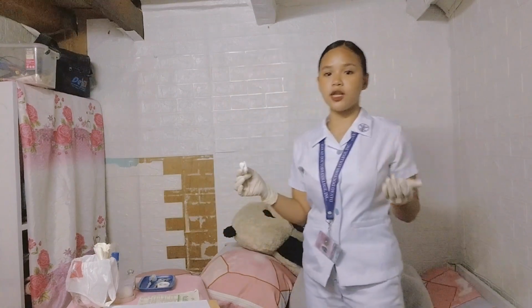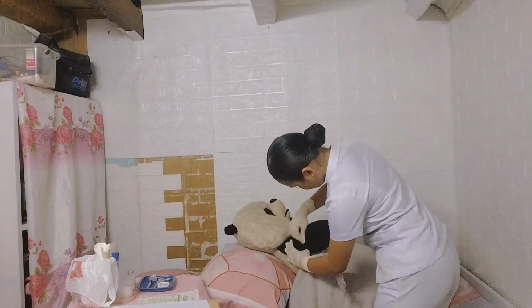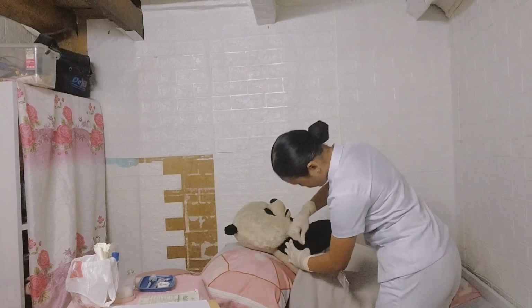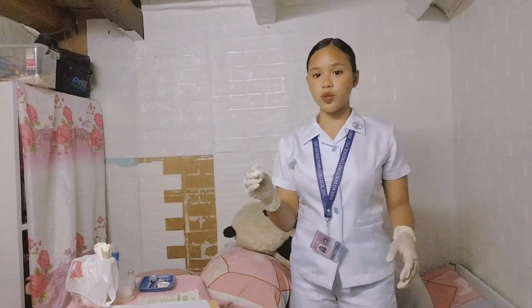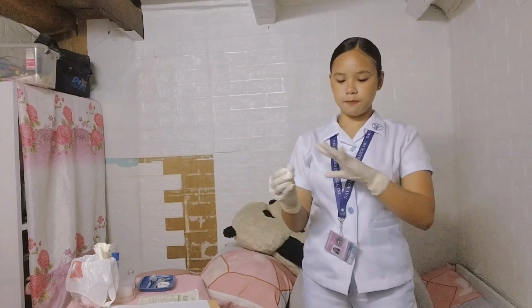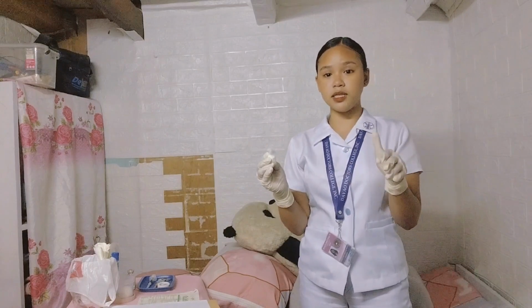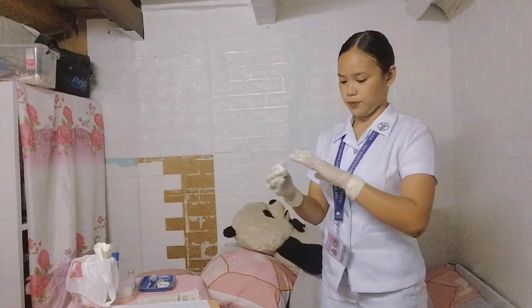Start at the center and move outward about 5 centimeters. Then discard. And then transfer and hold the swab between the third and fourth finger of your non-dominant hand. This is done in readiness for needle withdrawal.